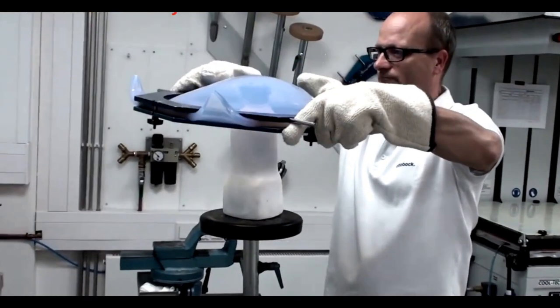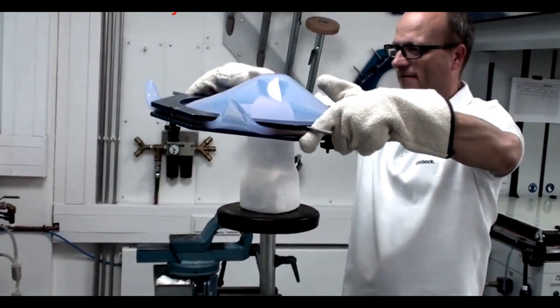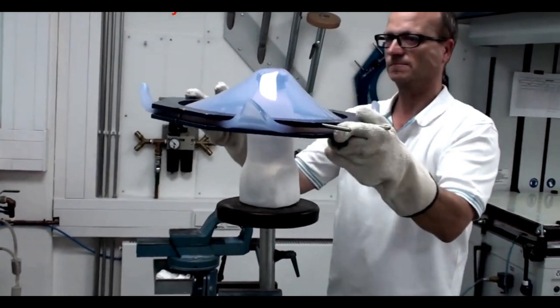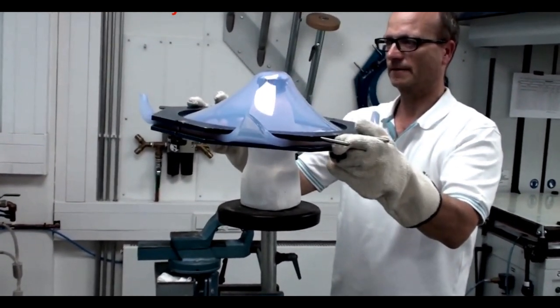In order to thermoform the check socket, use 12mm thick thermoplastic and blister form as you normally would.